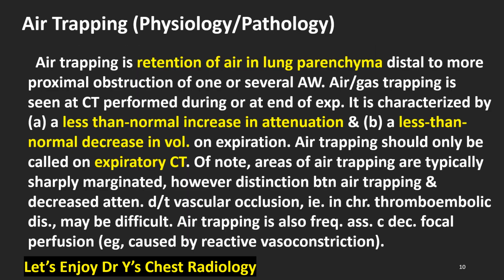Air trapping, physiology, pathology. Air trapping is retention of air in the lung parenchyma distal to more proximal obstruction of one or several airways. Air or gas trapping is seen at CT performed during or at end of expiration. It is characterized by a less than normal increase in attenuation and a less than normal decrease in volume on expiration. Air trapping should only be called on expiratory CT.